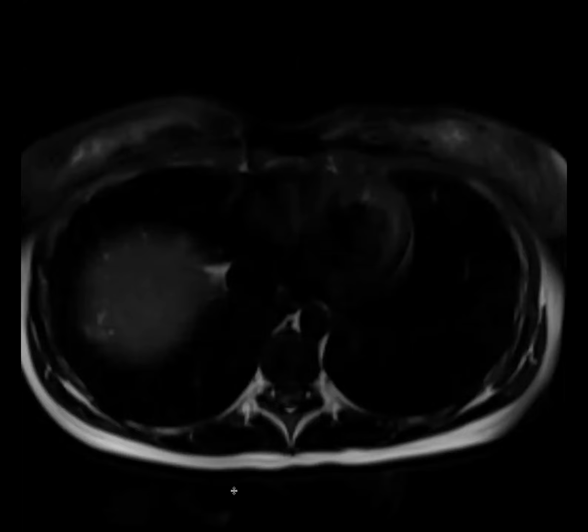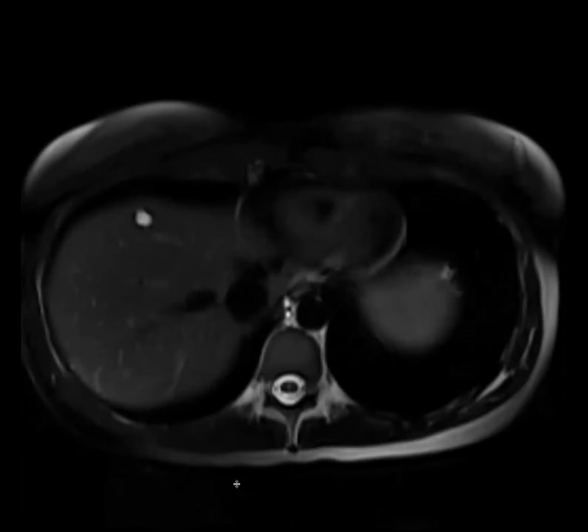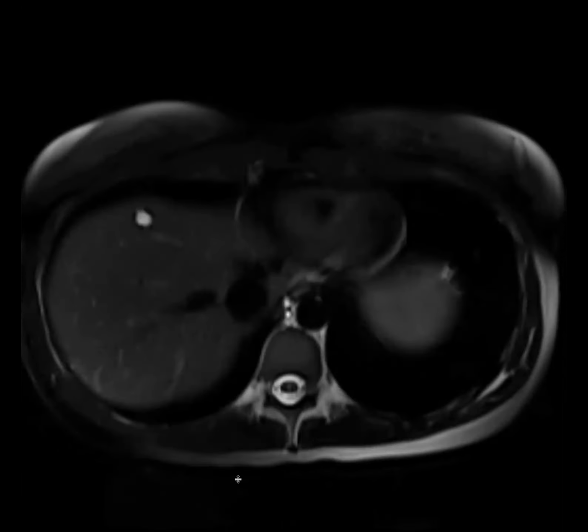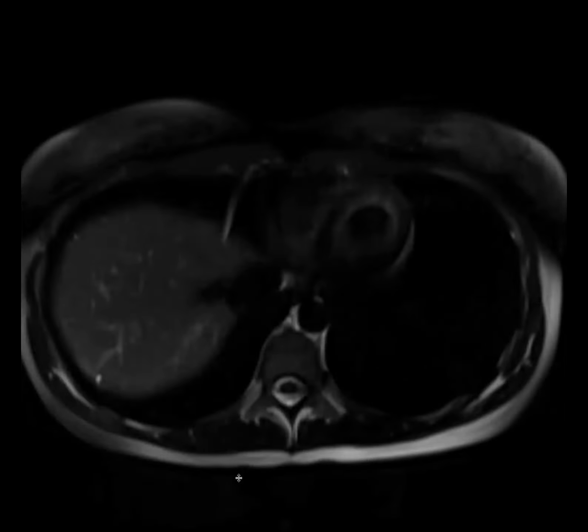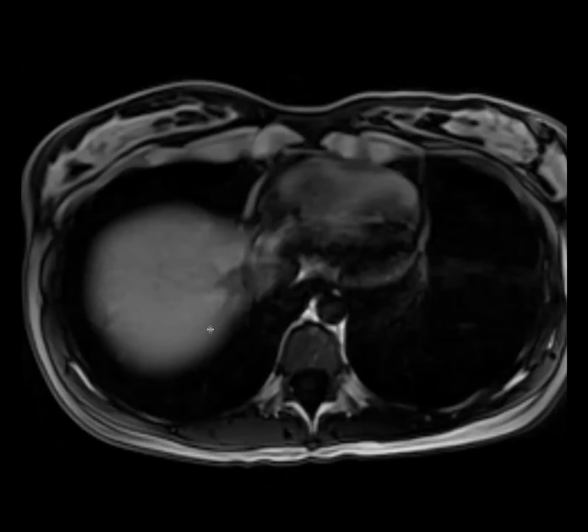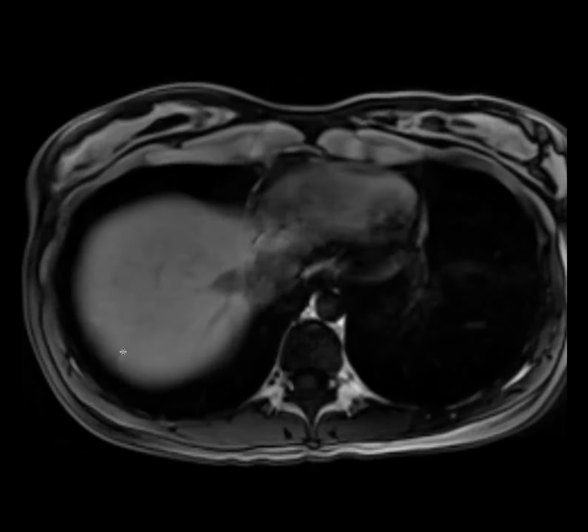Yes. Here's your fast T2. I just showed a case like this at our case conference like a month ago. Mine also had endometriosis in the pelvis, but then it spread along the liver dome. Yes. So here on the T2 fat sat, you see these little T2 bright areas. You don't always see this T1 bright. This is what you want to see, but you don't always see it.